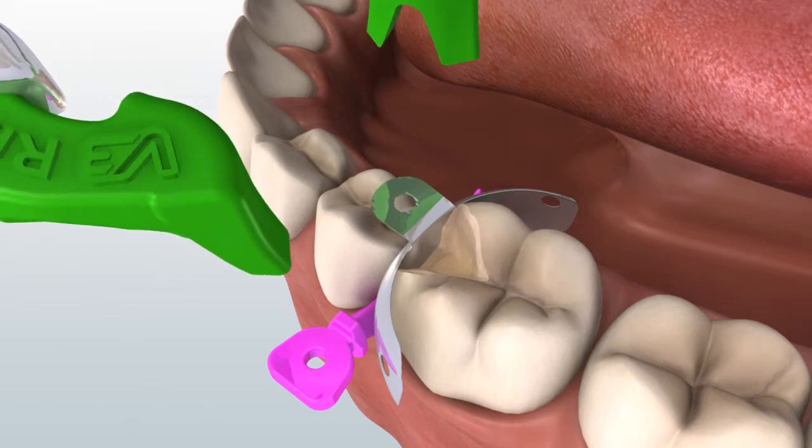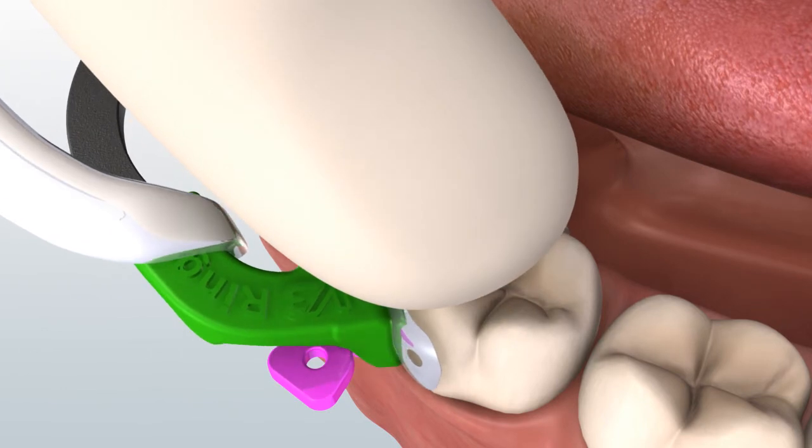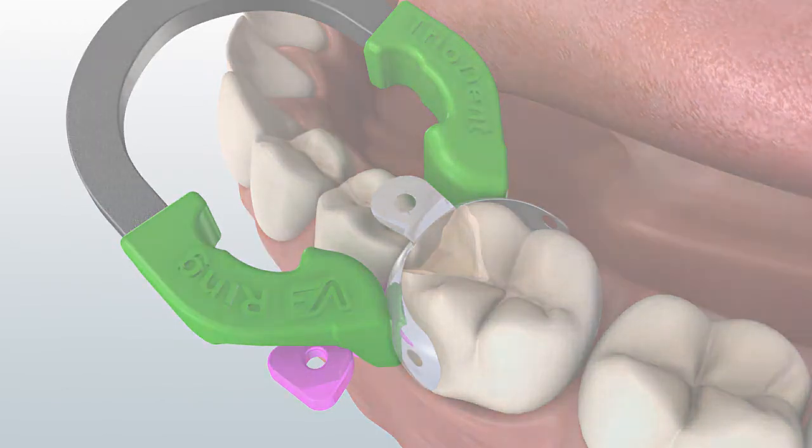Make sure the ring is fully seated, mesially or distally, in direct contact with the wedge, with the ring tines behind the matrix and straddling the wedge. Press down with a finger on the matrix tab and V3 ring while removing the forceps. This prevents movement and keeps the ring down.